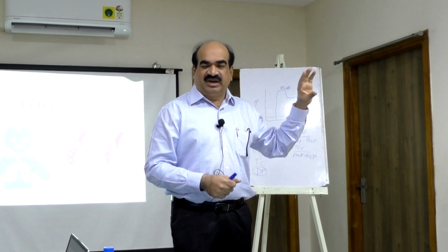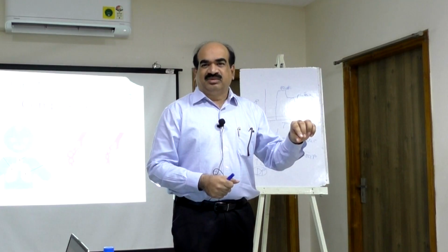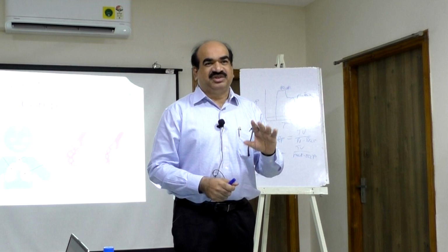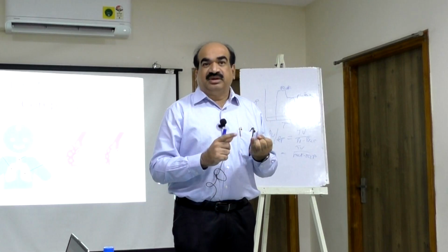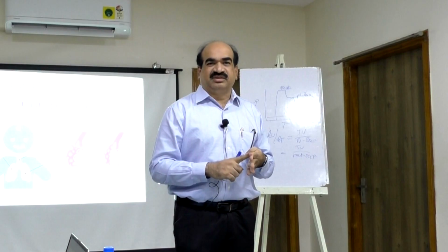Patient, ventilator graphics, and monitors, they are ready to tell stories. Only thing is, we should listen to them. We should be a good listener. Scalars give a lot of information. Okay. Then compliance, elastance, resistance, then conductance.